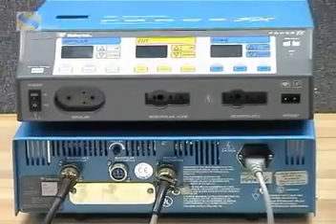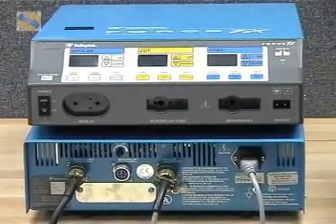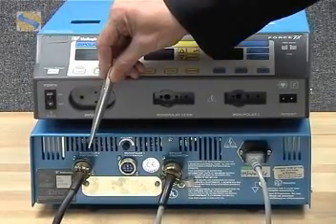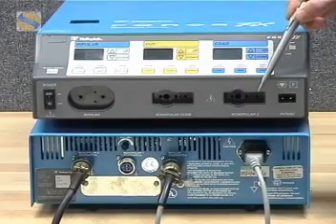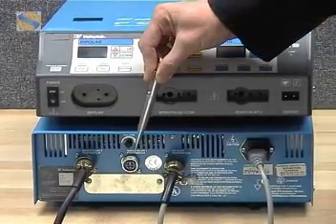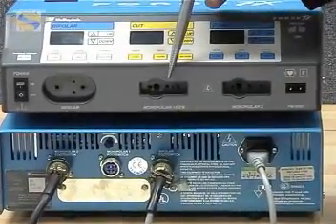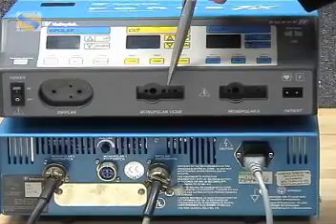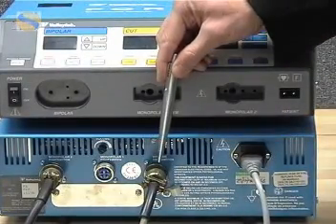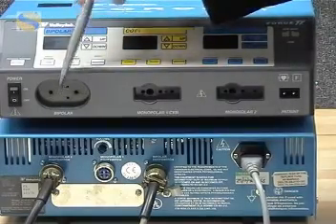Each of the back panel connections relate to the front panel outputs. Monopolar foot switch 2 on the back of the generator controls the monopolar foot switch 2 output on the front panel. The monopolar foot switch 1 on the back of the generator controls the monopolar 1 output on the front panel. Similarly, the bipolar foot switch connector controls the bipolar output on the front panel.